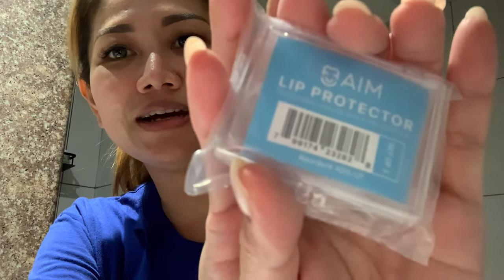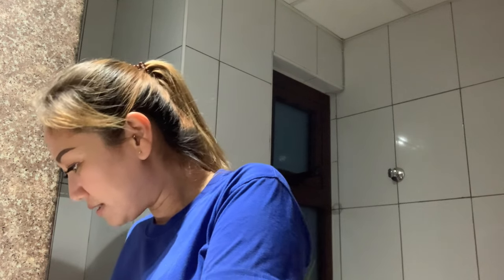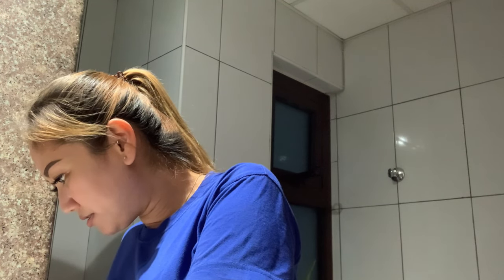I ordered two so that I have extra, and it comes with a case. The name is AIM Lip Protector — this is the brand. It has a set of two already: one for upper and one for lower teeth. According to the description of the seller, it will fit any standard shape of oral dental appliance because it's a dental one.